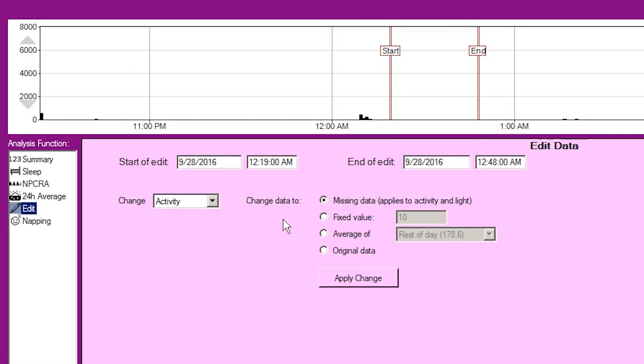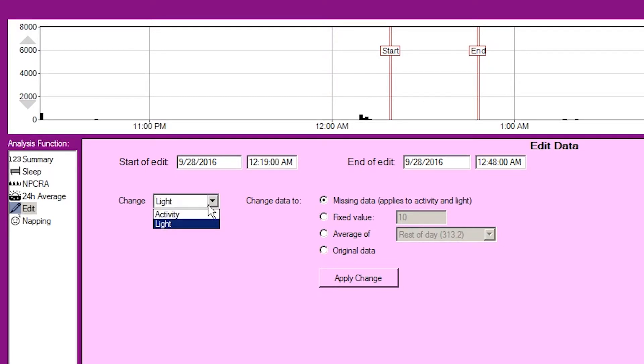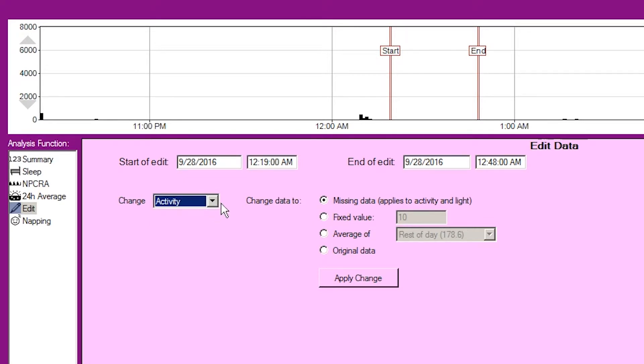Next, you must choose to change either the activity or light channel as appropriate. Note that marking missing data will cause both to be considered as missing.